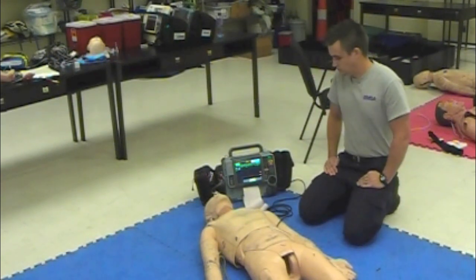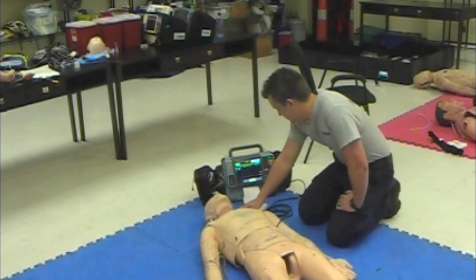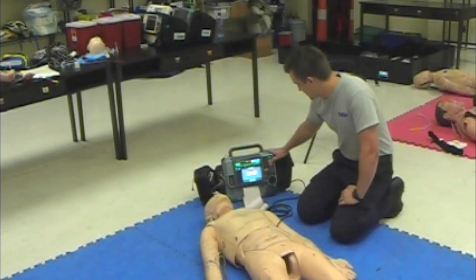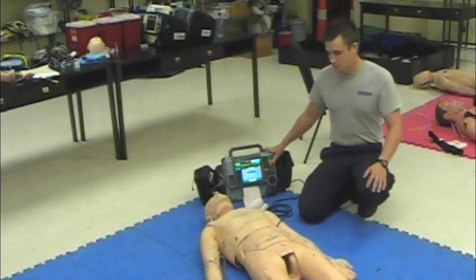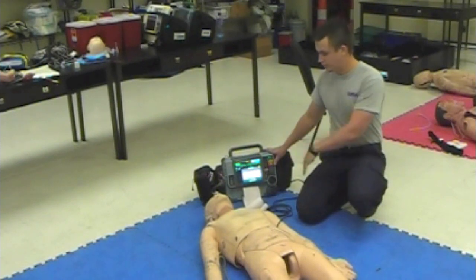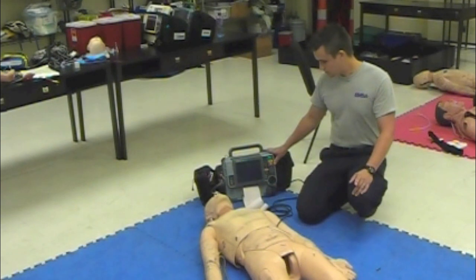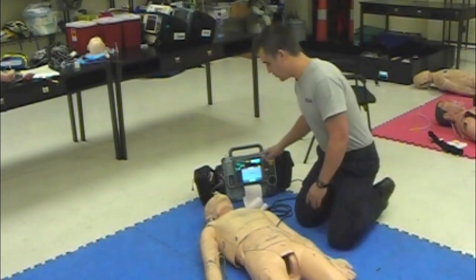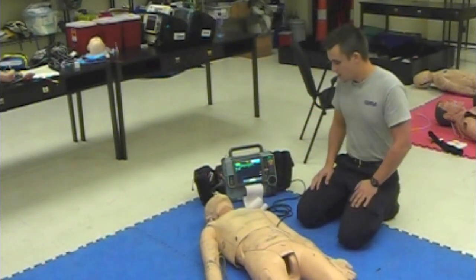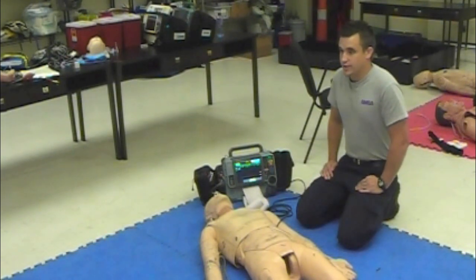All right. It's been 2 minutes. Okay, we're going to do a pulse check. Do you have a pulse with this? No pulse. I'm going to charge it up to 360 again. Off compressions, off ventilations. I'm going to shock on 3. Ready, 1, 2, and 3. Okay. So back on compressions, back on ventilations. And since I pushed my drugs the last 2 minutes, we're going to wait for our second 2 minutes.